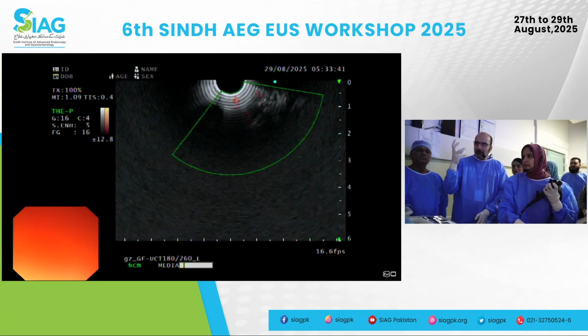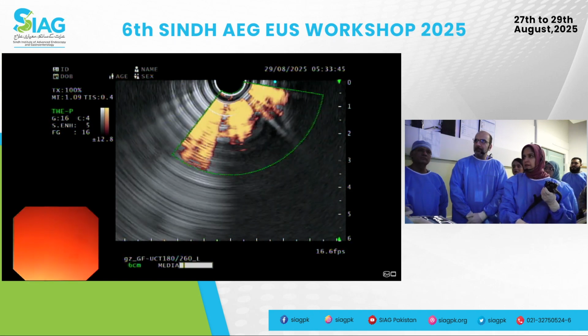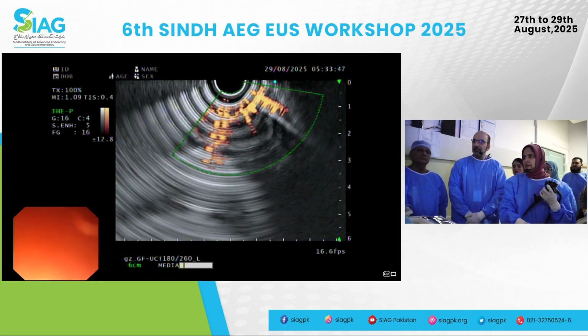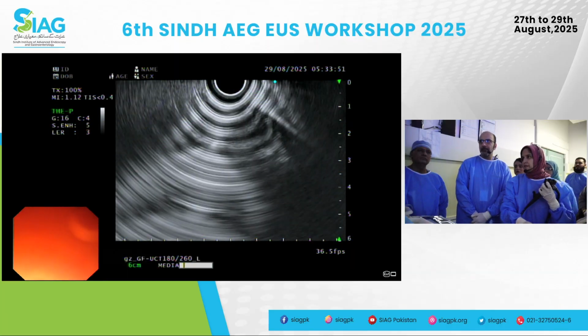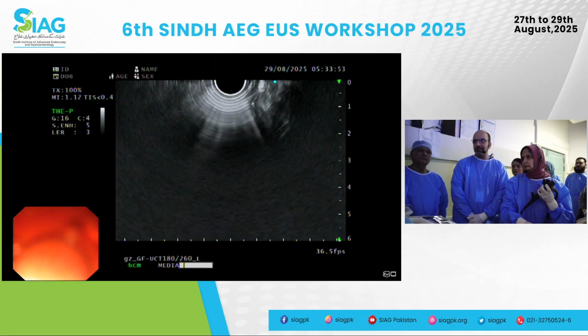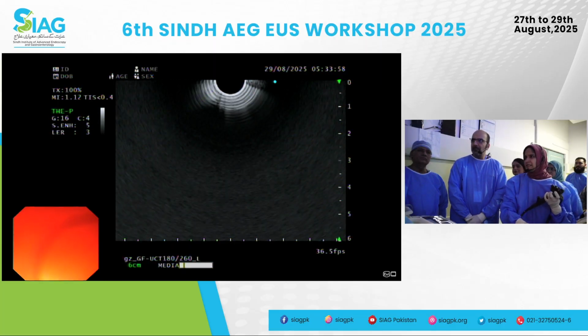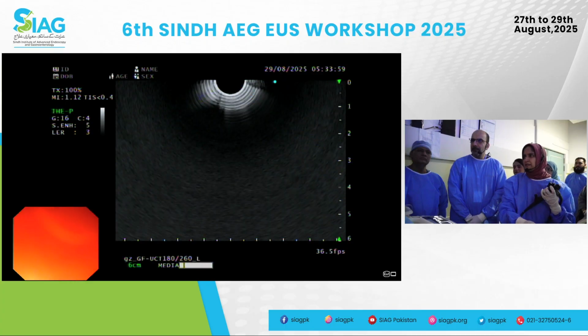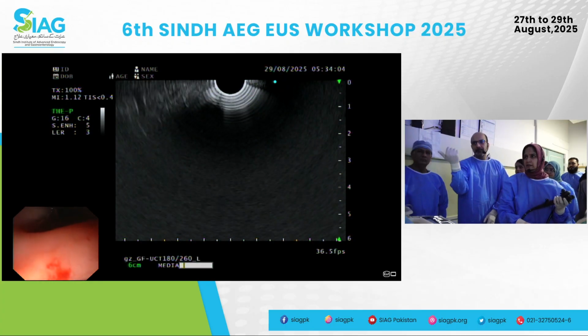So you can put your balloon up a tiny bit. That'll help you sometimes in these situations. Just a tiny bit. Now suction. Okay, we're going to get rid of the Doppler for a second. There's a lot of air in the balloon. That's why you got this. We checked our balloon. Yeah, go ahead and advance the scope again. I lost the contact somehow. Pull back, because you have air in the balloon area now.